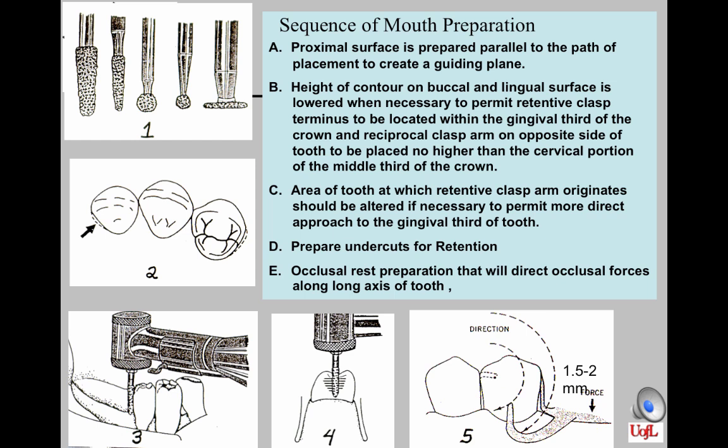A guide plate on the anterior tooth should extend as illustrated on number 2 above. It stops just lingual to the cusp tip so that the metal does not extend where it becomes visible and unaesthetic. This can vary, though, if the tooth next to the edentulous area has leaned dramatically to the mesial. Sometimes that happens.